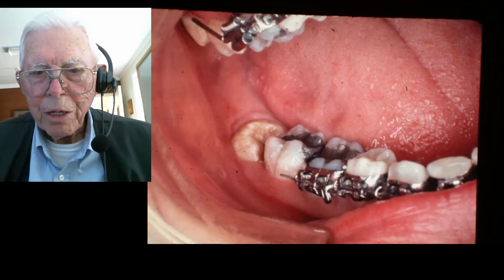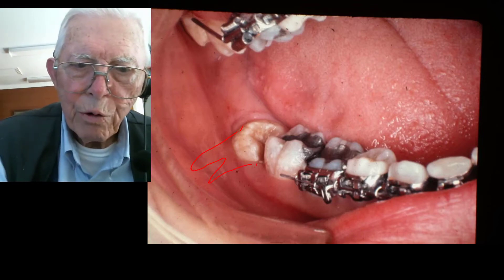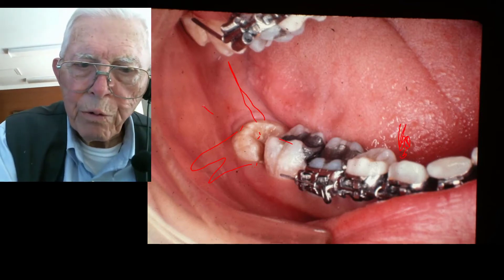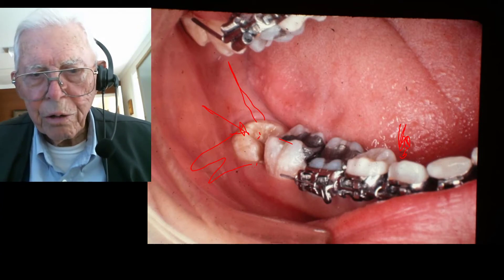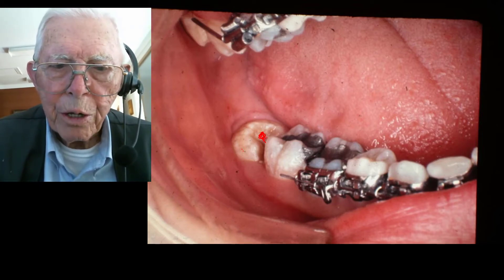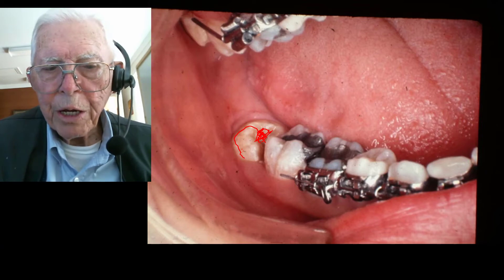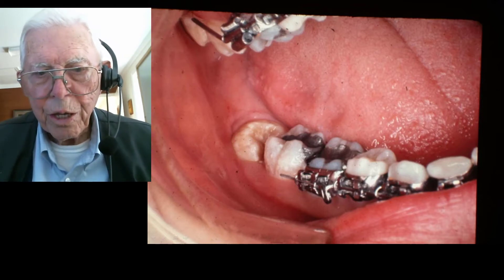What I want to show you is here is a molar tooth which is lined up out here somewhere, and we want to upright this. She's got all kinds of room for it and we've sacrificed a bicuspid up here, and we want to bring this in and upright it. Now they did not have any bonding material back then, so I etched and washed and dried this tooth down on top. I knew I had to be over to the side with the spring, so I put a lump of acrylic in there, and before it hardened completely I embedded this wire in it that goes over like this and has the spring in it that picks that tooth up.